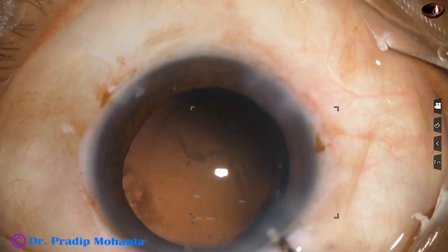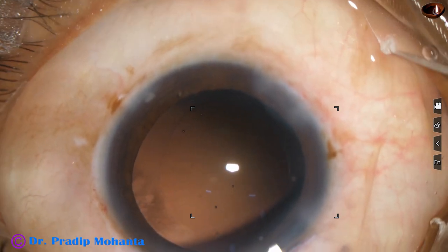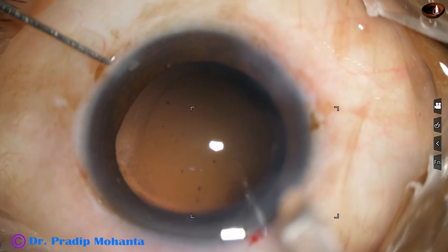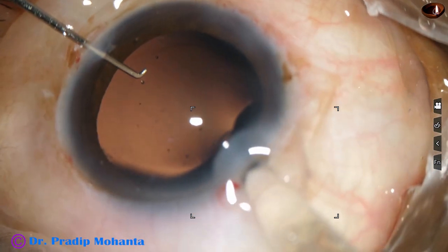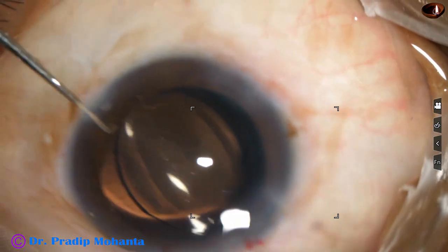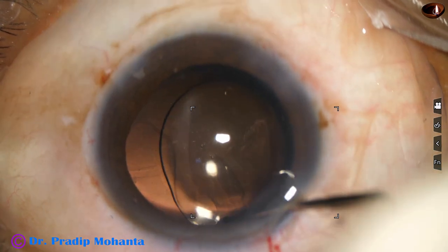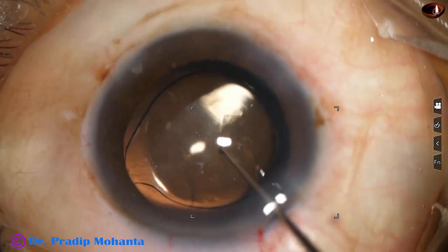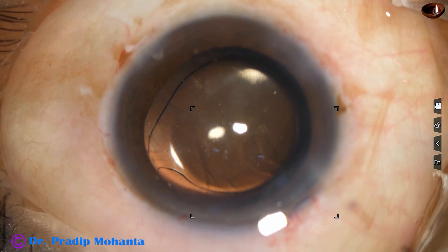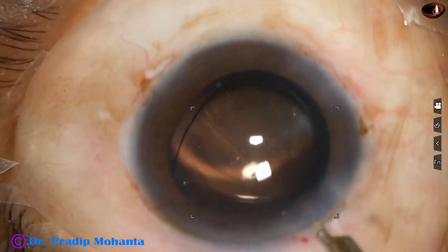Now visco and we are ready for implantation of the intraocular lens. The intraocular lens is hydrophobic acrylic, single piece, monofocal, aspheric. It goes in the capsular bag very nicely. The haptic is placed in such a way that it gives additional support to the dehiscence area.